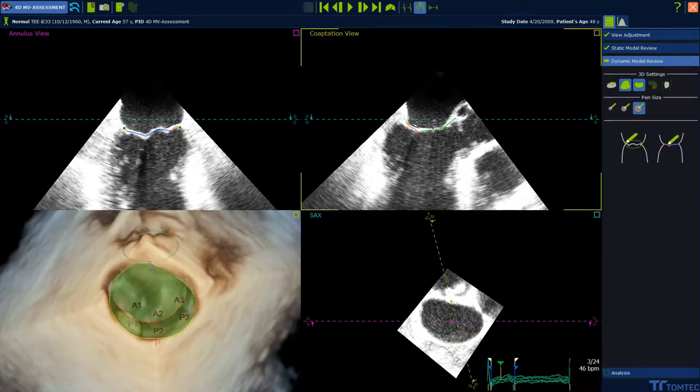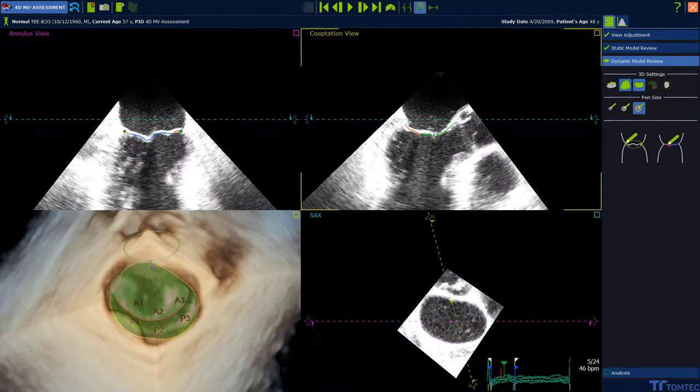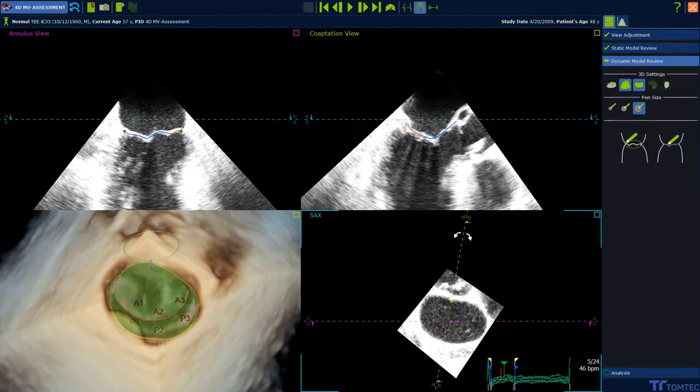Adjust the proposed contour of the leaflets in each frame by drag and drop if necessary. Use the next frame or previous frame button at the toolbar to continue to the next frame and make further adjustments.